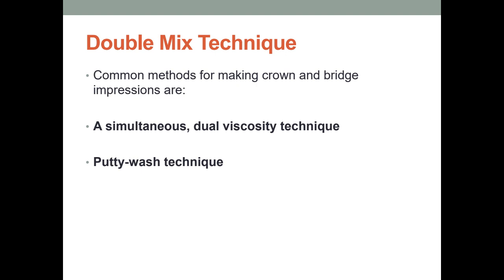Now the second technique which we can read is the double mix technique. There are two types of technique depending upon the material: a simultaneous dual mix technique and the putty wash technique. This is only a difference of material. We will see in the further slides.